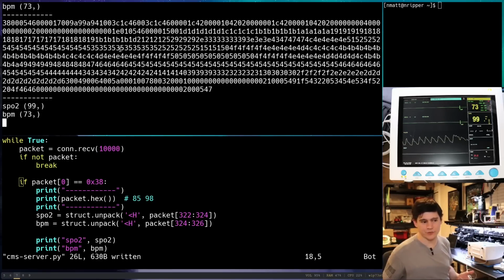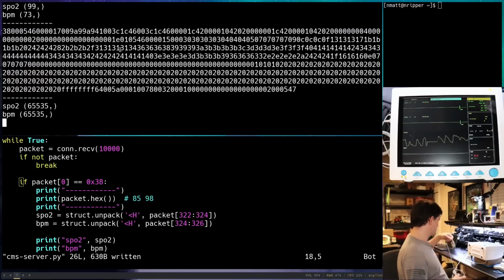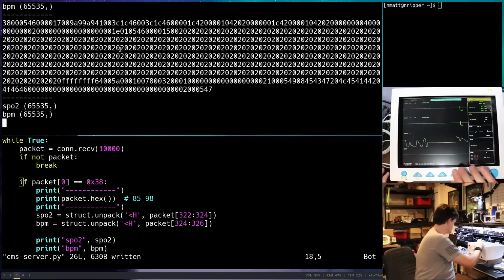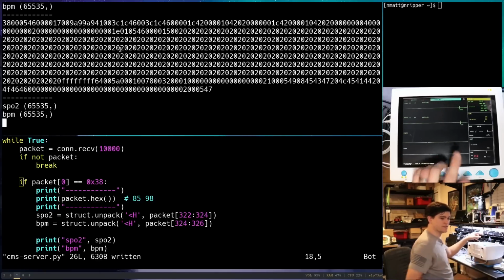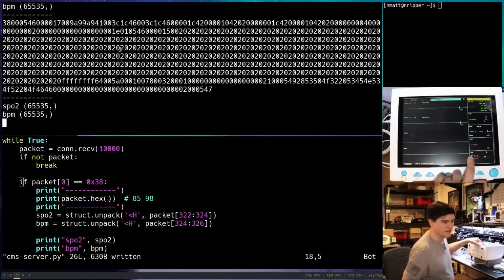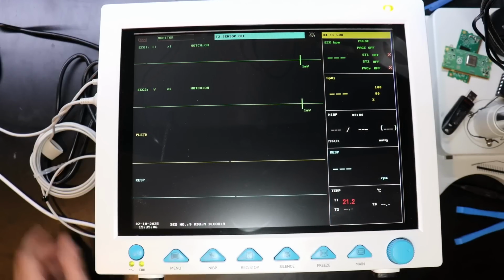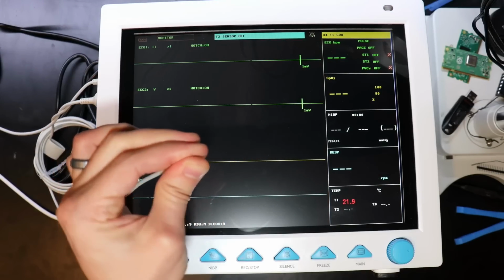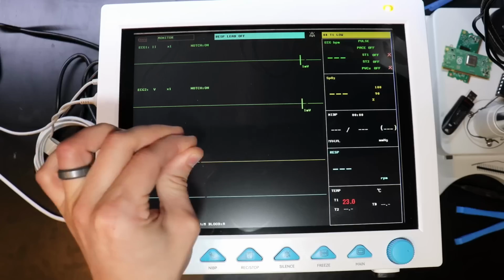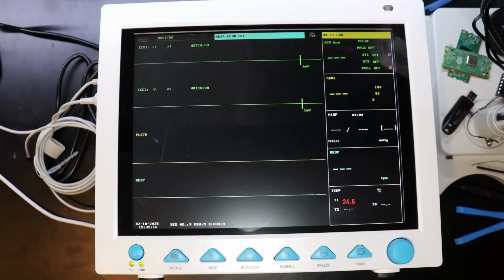That is really cool. So we're going to do one more field, and this is a fun one. And I'm going to tell it to silence. That's really annoying. And so it's kind of hard to see. You're just going to have to trust me down here. Maybe we can switch to the desk cam really quick. Aha, there we go. You can see that this says temp T121. So that is this little skin temperature sensor. So I can hold it with my fingers and it will get bigger. So that is kind of cool.